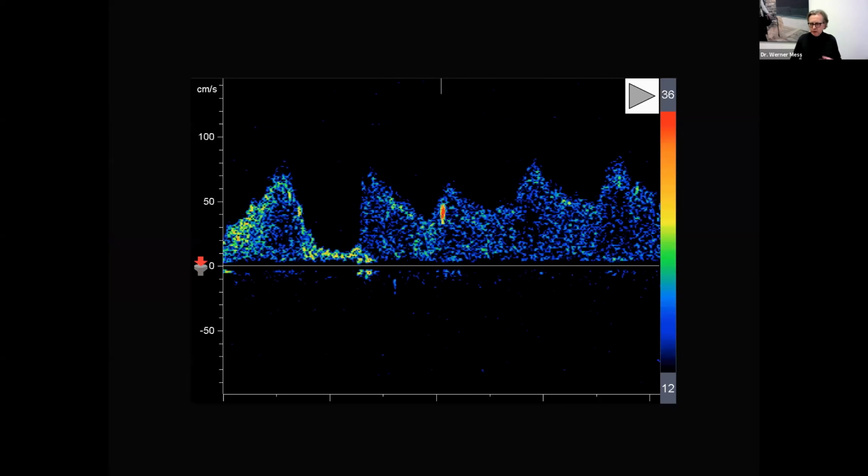And this shows what the basic idea behind microembolic signal detection is, especially when it comes to plaques in the carotid artery. This signal has been recorded just before cross-clamping the carotid artery. So the neck is opened, you can really see the internal carotid artery, and the surgeon has a small rope and lifts up the vessel a little bit.